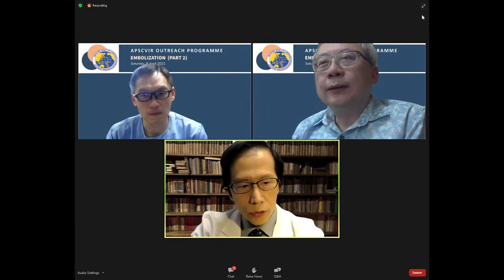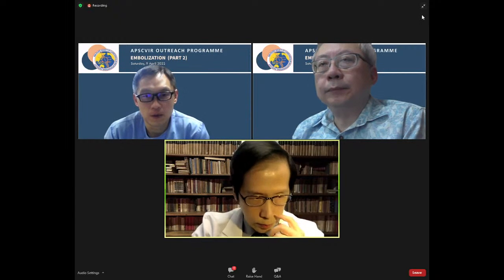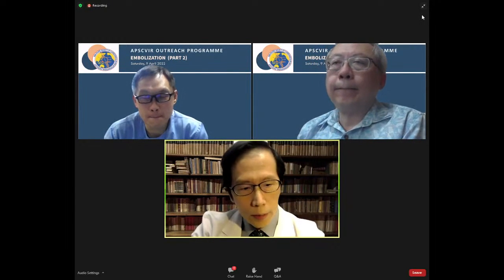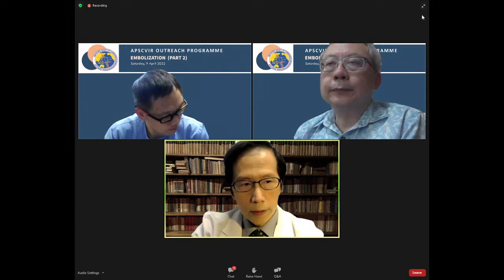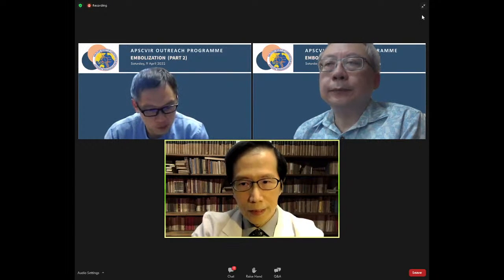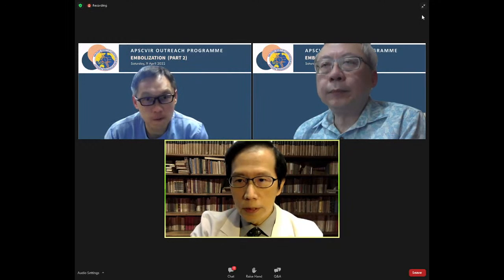In the initial phase, I used it to help me recognize the different branches, to see which branches are safe to embolize and which are not. But then when the radiologist is trained, after such a learning period, I think DSA would be good enough to save a lot of time, and also the high definition, high precision of the DSA image would be very sufficient for this purpose.